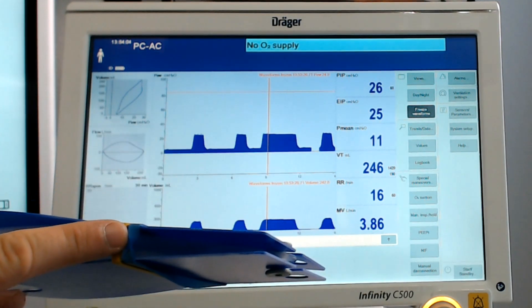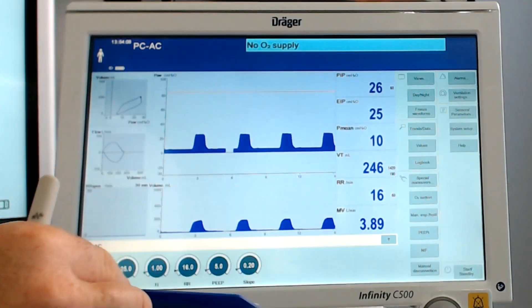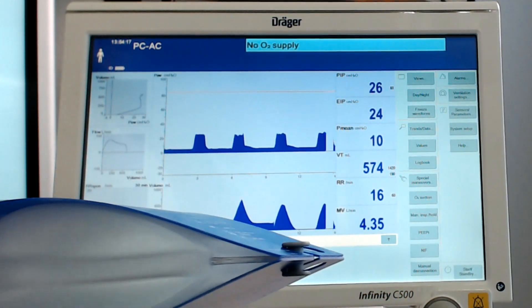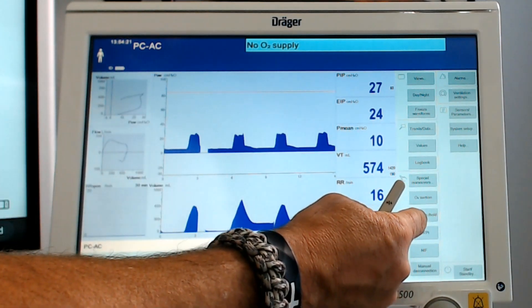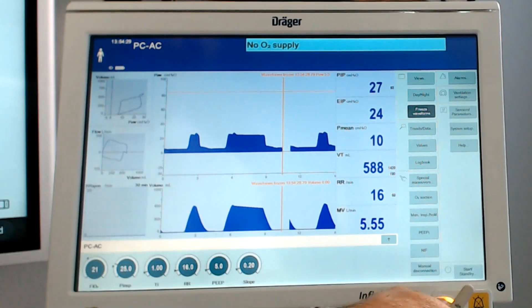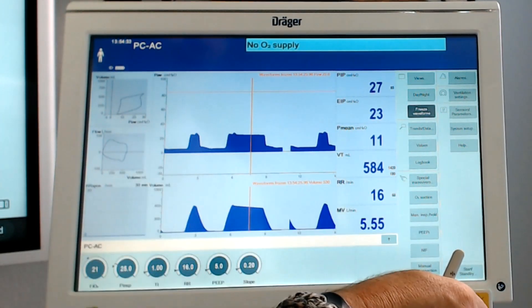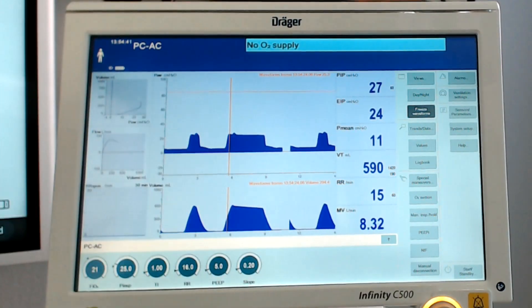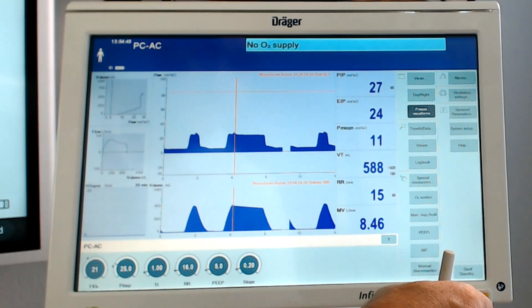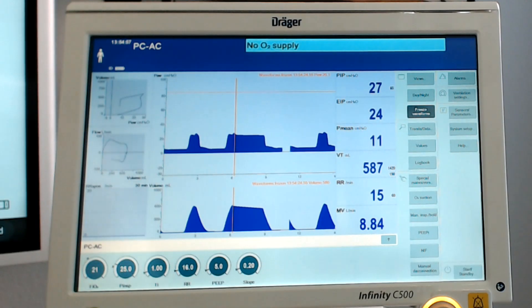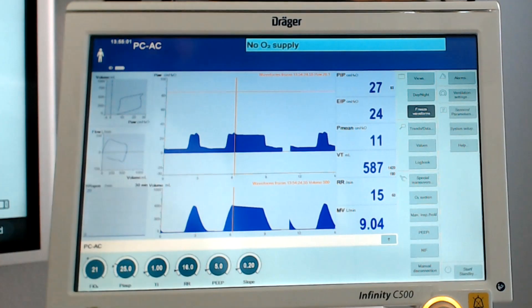Let's take both rubber bands off and see what happens when we see an improvement in compliance. I no longer have a rubber band on here, so this is going to simulate an increase in compliance. When we do an inspiratory hold, freeze the waveform, and come back and look - our plateau is about 24, and our peak inspiratory pressure is right there at 25. Our peak volume delivered was 580 milliliters. We see where all of these are telling the same story.